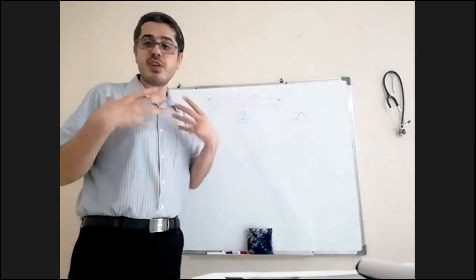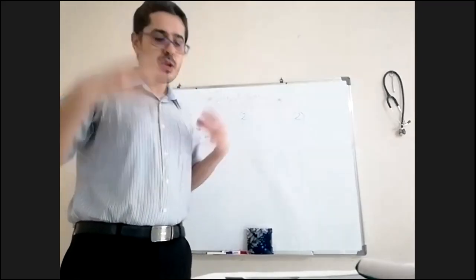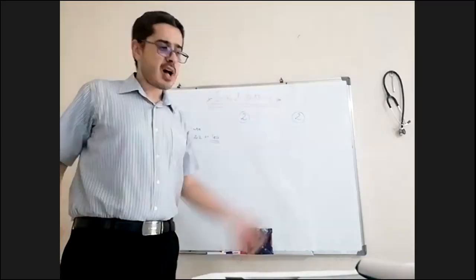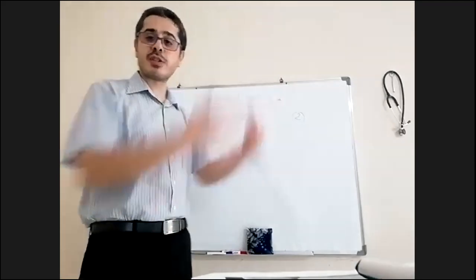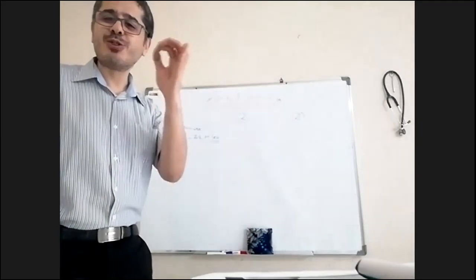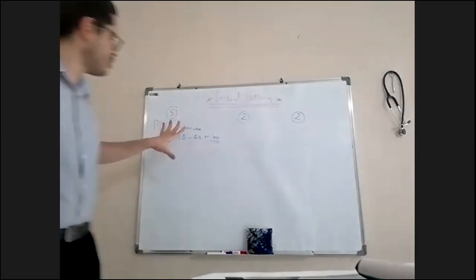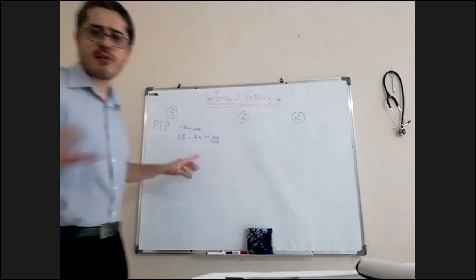The lung was very nice. There was no infection, no problem in the respiratory system. The problem was only the hydrocephalus. So despite it being 5 ml per kg, the chest was moving too much. I asked the anesthetist to reduce. We reduced to 4. Still the chest rose too much. We reduced to 3. Still too much. Until we made it 2. After that, the anesthetist could not reduce anymore. Cannot give less than that. So always be sure you look at the chest rise and see the air entry. You can give less to avoid lung injury.